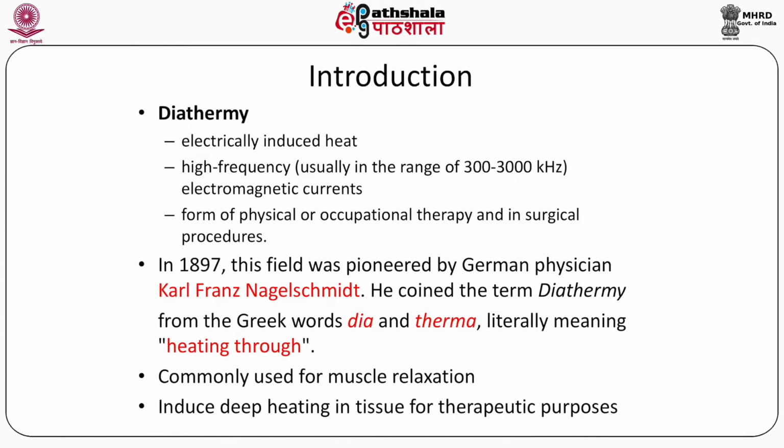To introduce the topic, first of all, what is diathermy? In simple words, it is electrically induced heat. To define diathermy, it is the use of high frequency, usually in the range of 300 to 3000 kilohertz, to induce electromagnetic currents, and it is used in the form of physical or occupational therapy and in surgical procedures. So, this is a brief introduction about diathermy.